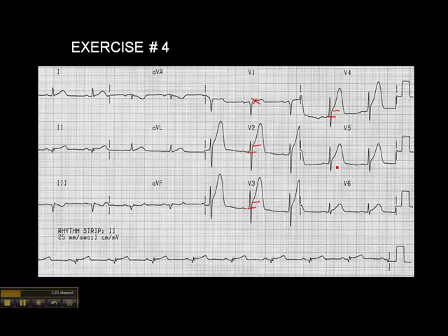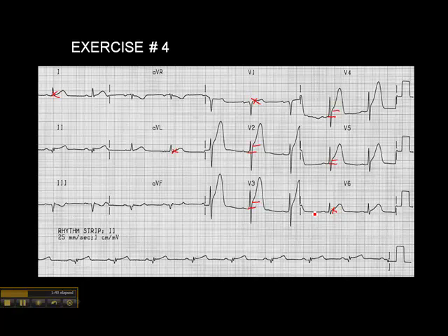Now let's see if we have lateral wall involvement as well. There's definitely ST elevation in V5. Is there ST elevation in V6? I would say probably not, but it might be a millimeter. There's no ST elevation in lead 1, and there's no ST elevation in AVL. So what we have is an anterior wall MI. Is there a lateral wall MI as well? No, it doesn't meet the true criteria, but there's a good chance the patient may be headed down that path.